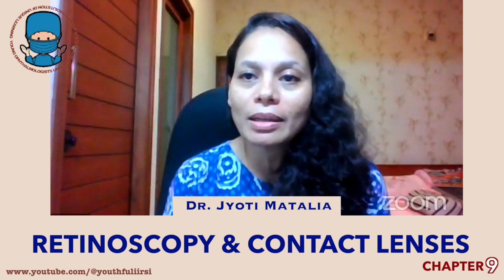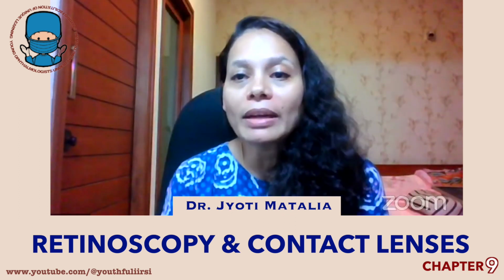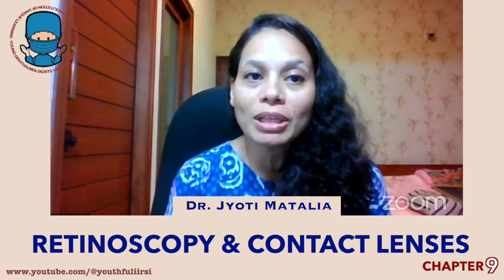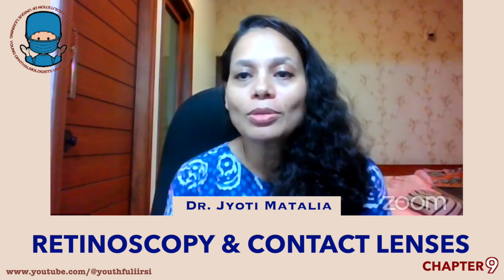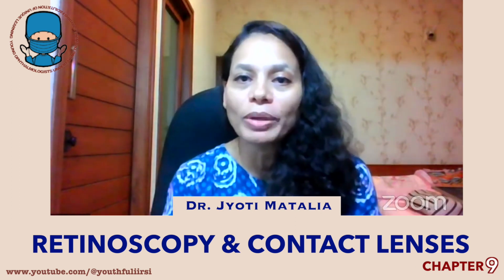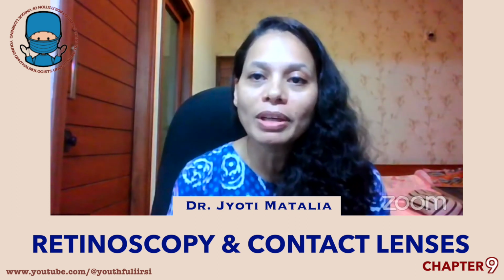One more point to add in pediatrics is myopia progression. With the sudden boom happening, we can consider this as one option. Though we are using low dose atropine, this is one possibility, especially if there is associated astigmatism. A lot of institutes are exploring it, and we are looking at starting this as a part of controlling the progression of myopia.